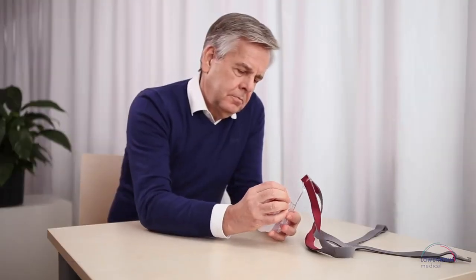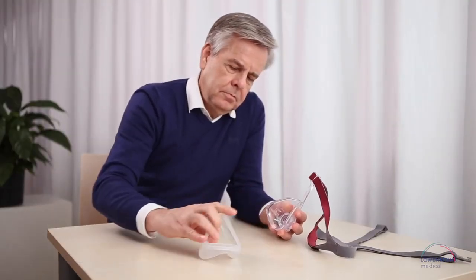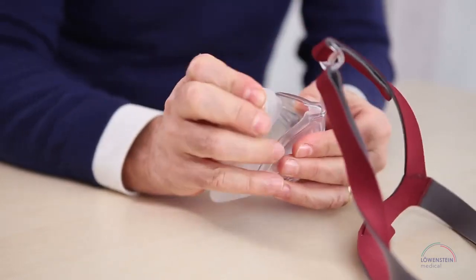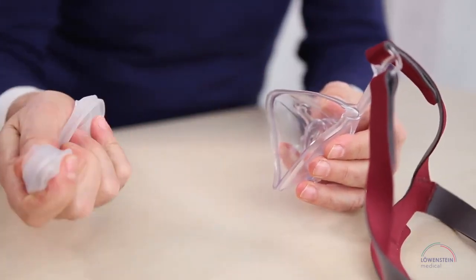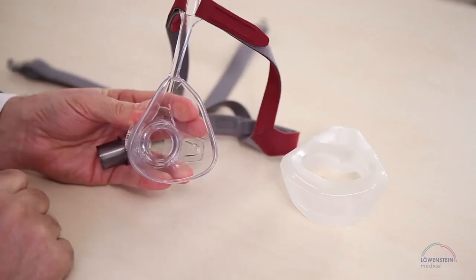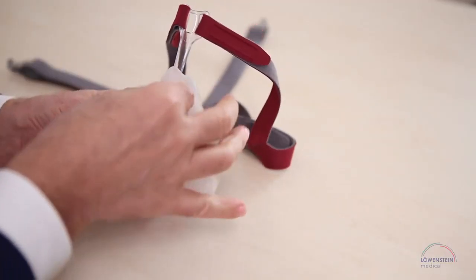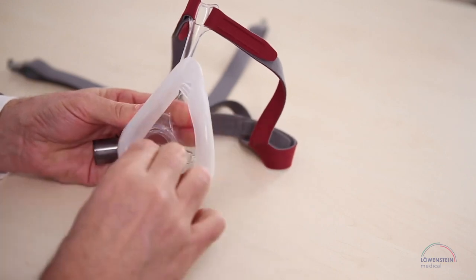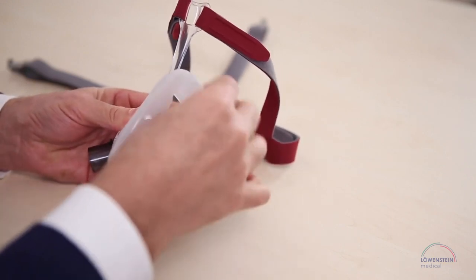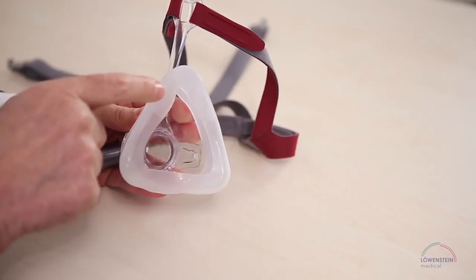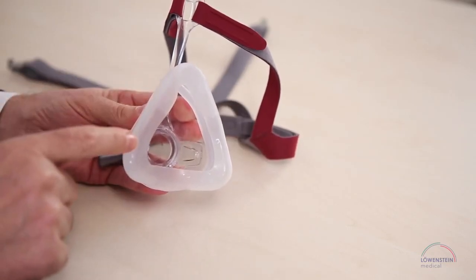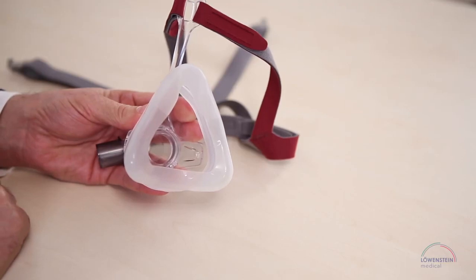You can remove the mask cushion very easily by pulling on it gently. It is made entirely of soft silicone. To fasten it in place again, start at the top and push it all around onto the mask body. The cushion has two different surfaces. The upper portion is soft and supple while the lower is firmer to keep the cushion in place.